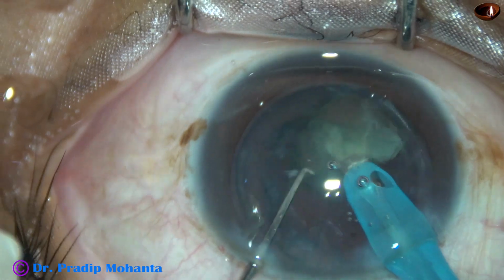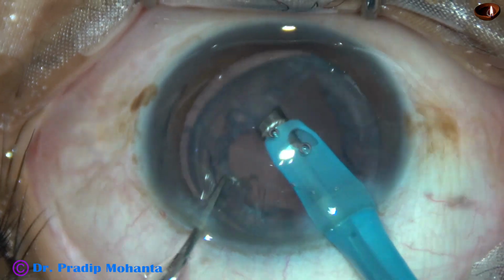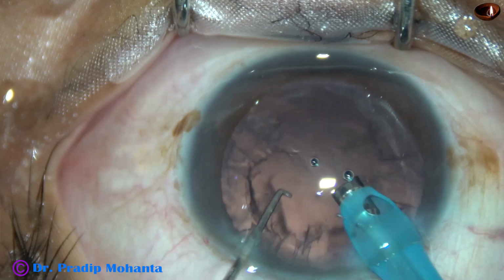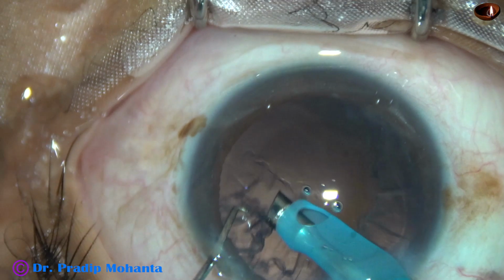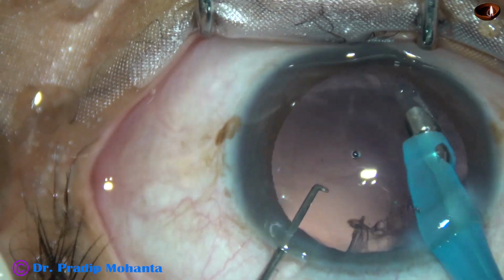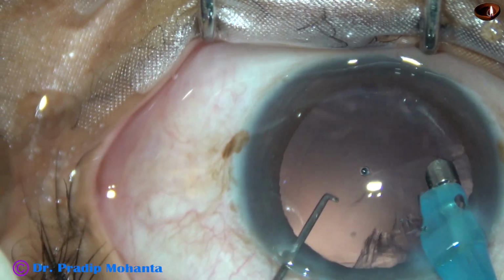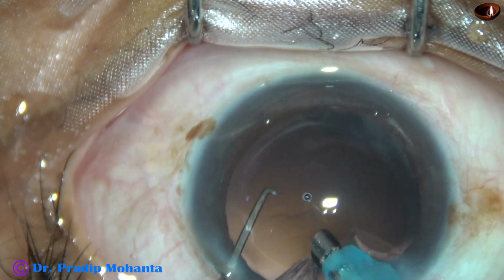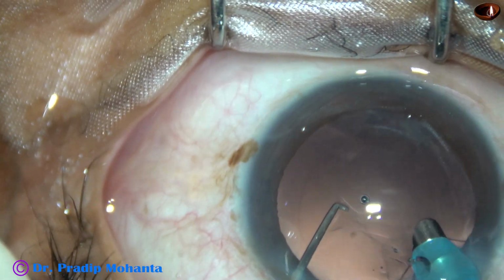Now the nuclear pieces are emulsified using ultrasonic energy. In this case the ultrasonic energy was set at 60%, but 60% energy was not used most of the time. And now watch removal of the cortex by the handpiece itself. At this time I am in very low vacuum, controlling by the foot switch, and I am very carefully removing the subincisional cortex.